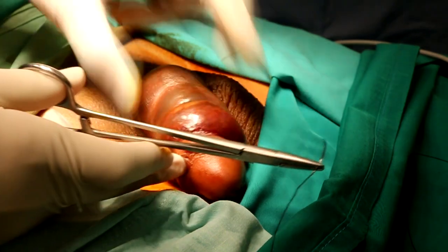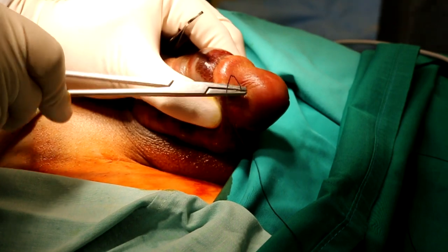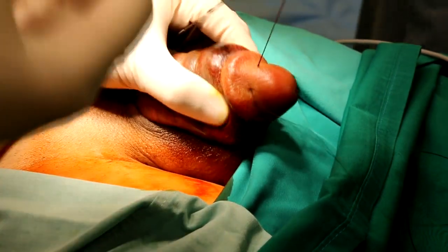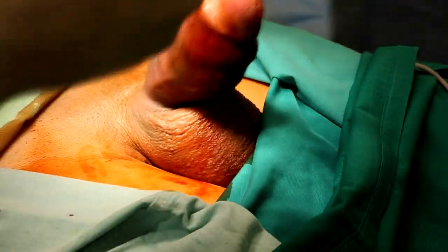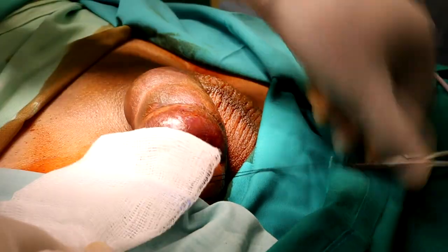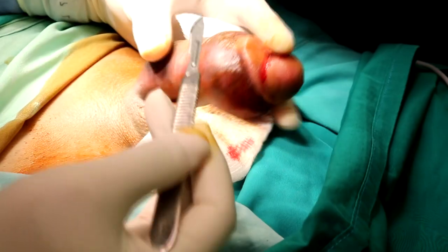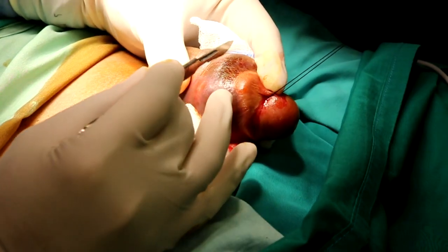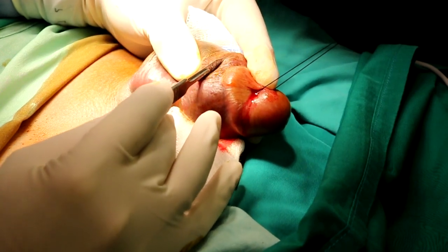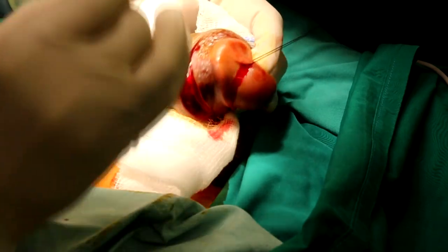Okay, so the classic exploration of the penis is through a subcoronal incision, and if you are operating on hypospadias, I think this incision is going to be familiar to you. So start with stay sutures, the first one in the glans penis, and a few millimeters proximal to the coronal sulcus. Make the incision in the penis circumferentially, all around the penis.